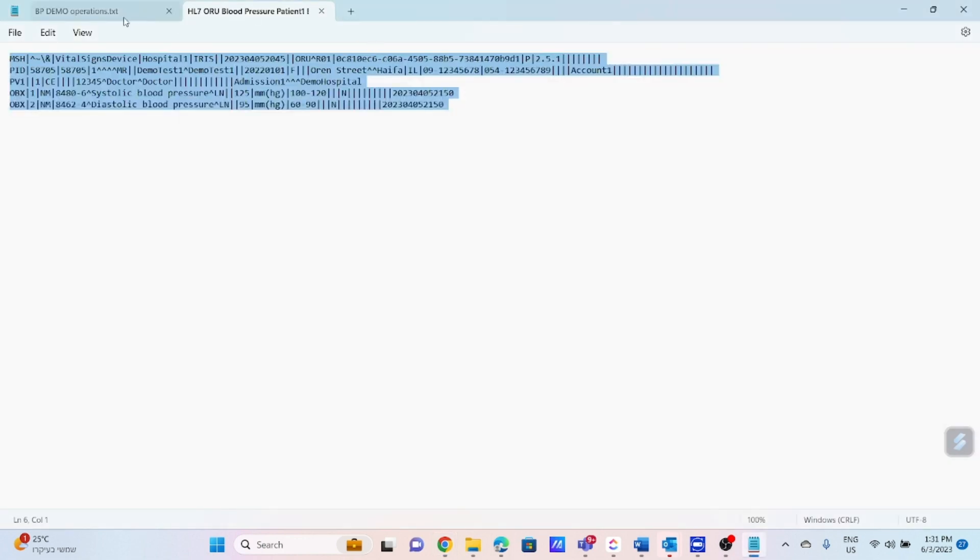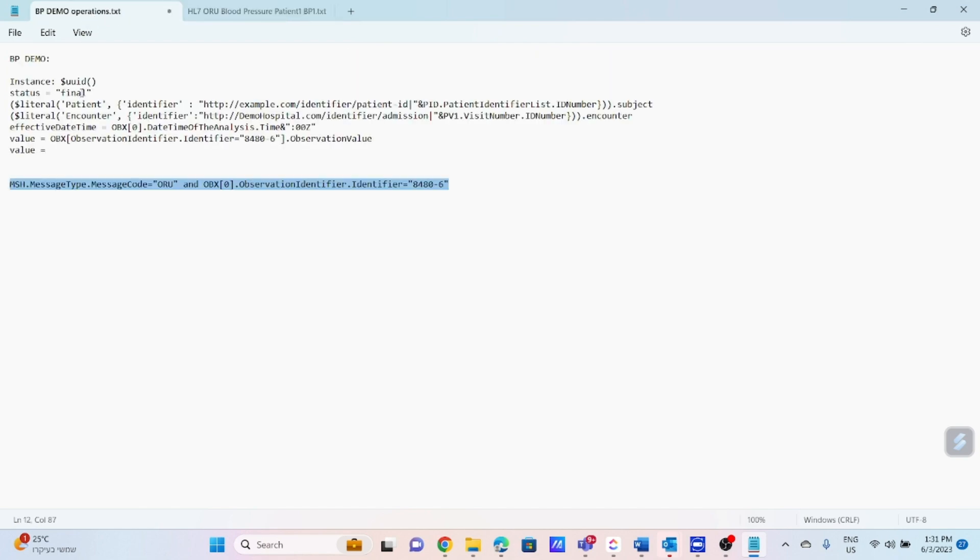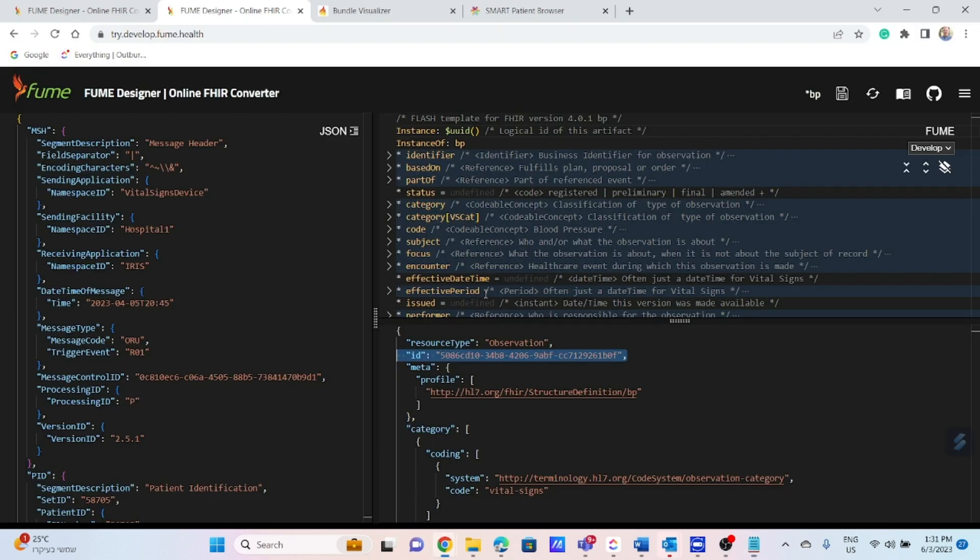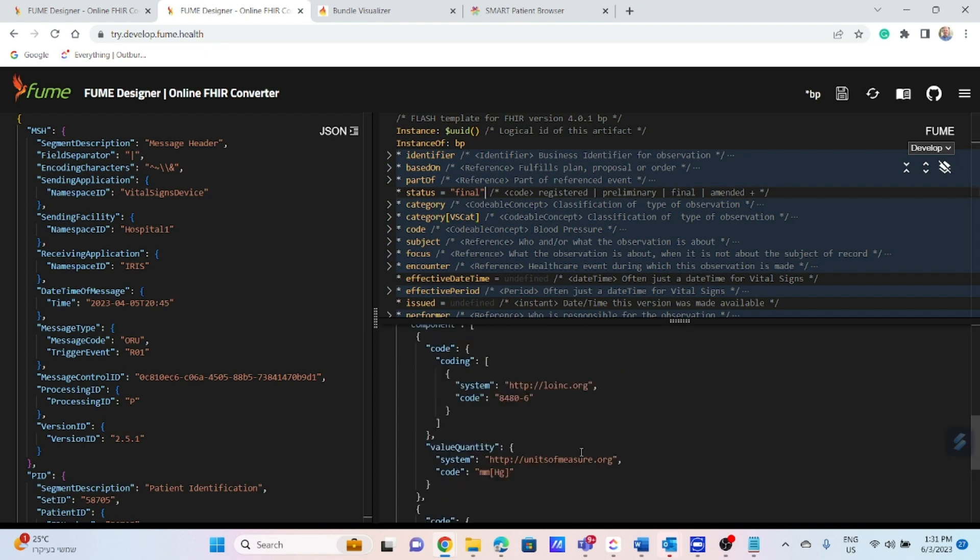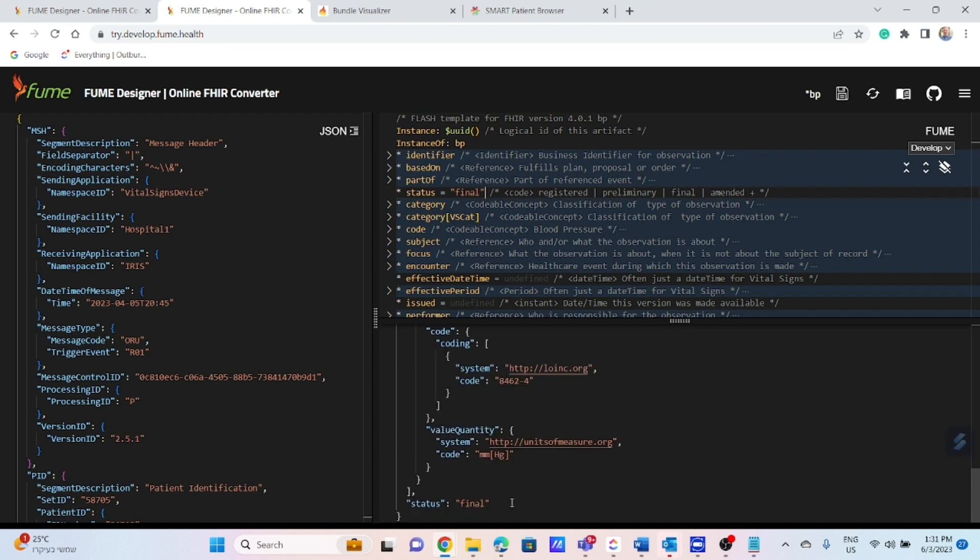The next one, we will create the status, which is defined as mandatory for the standard. You can see the transformation result in the result pane.